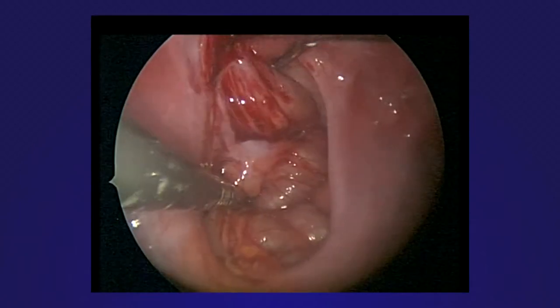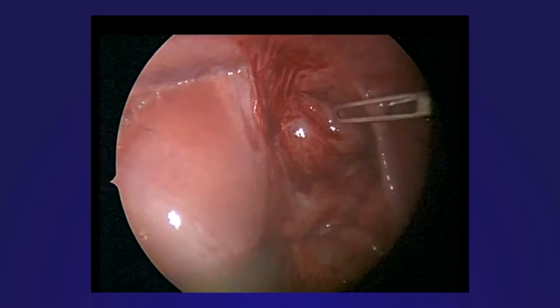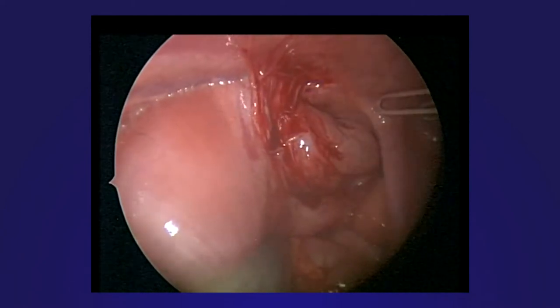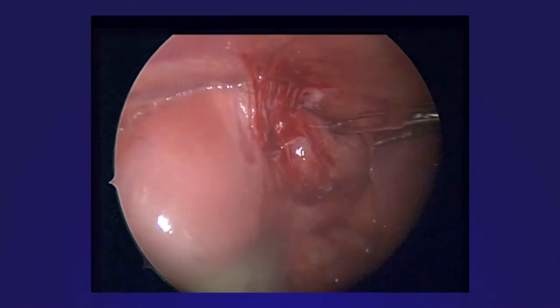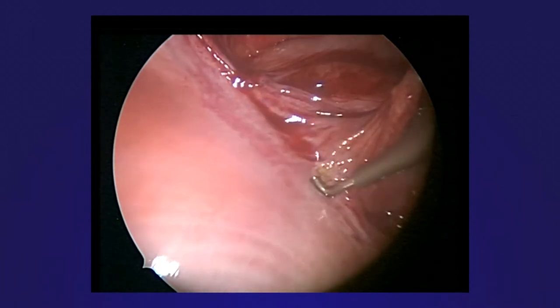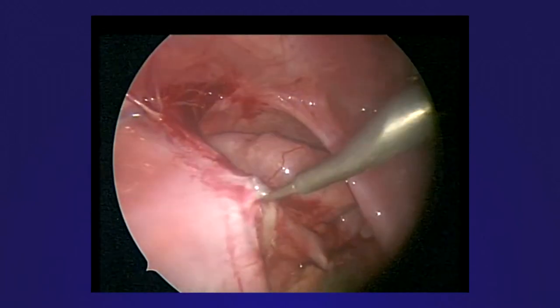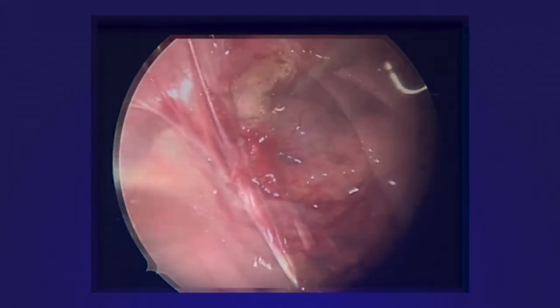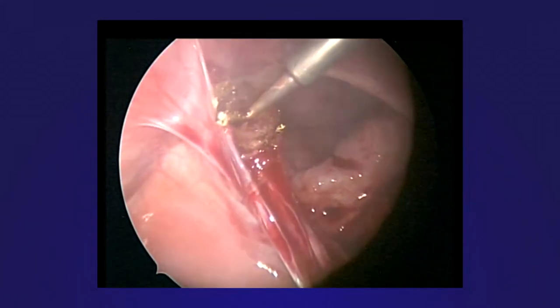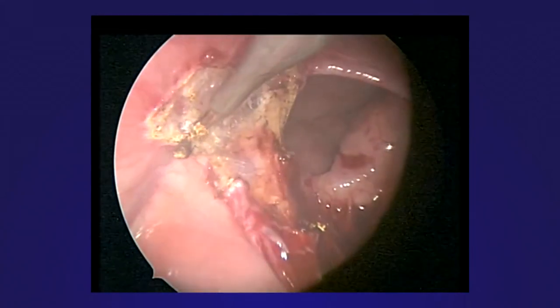One can see that the anterior rim of the defect is free while the posterior rim is adherent to a partial hernia sac. These adhesions are therefore divided with a hook cautery to free up the posterior rim and achieve full reduction. This is most important at the posterolateral margin where most recurrences occur.